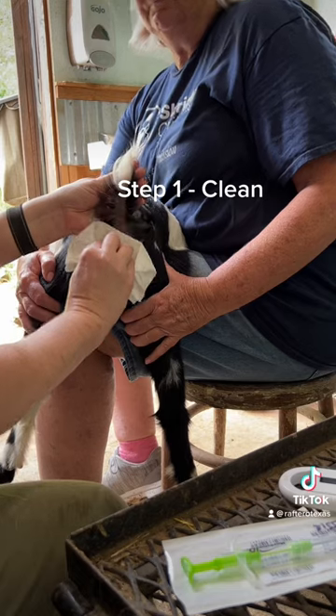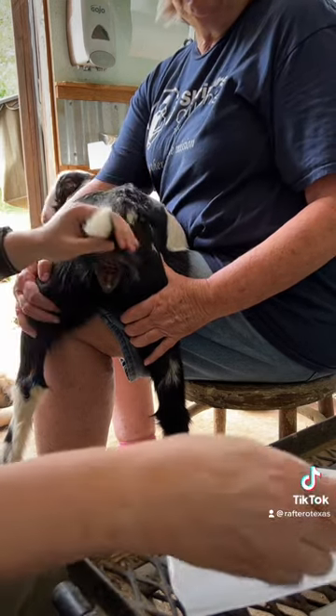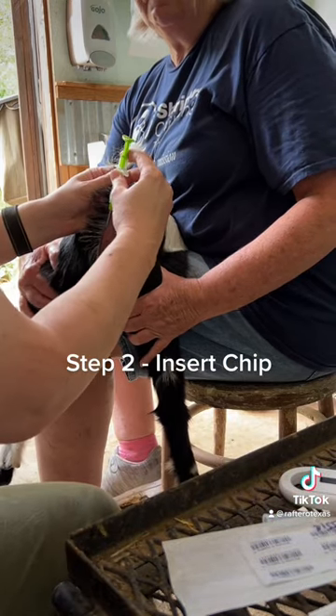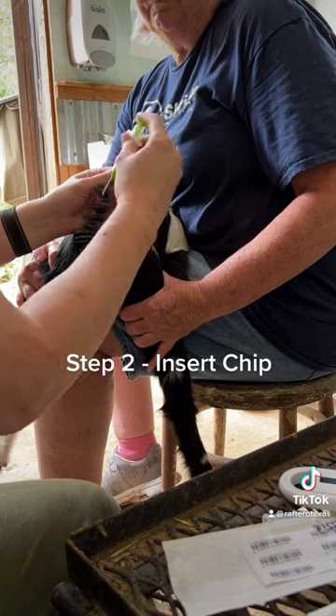We use a paper towel to dry the area, and then we're going to come in here with the microchip. We're going to go down — here we go. We're ejecting it — it's a little bit of a pinch — and insert the microchip.